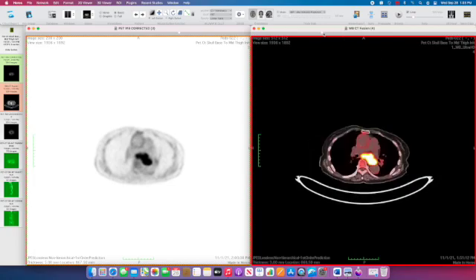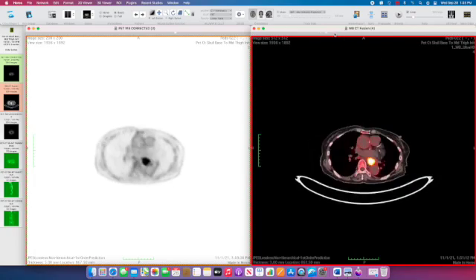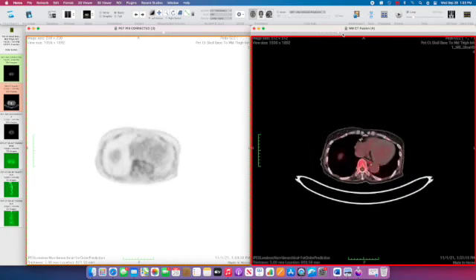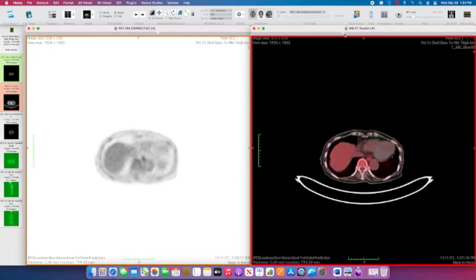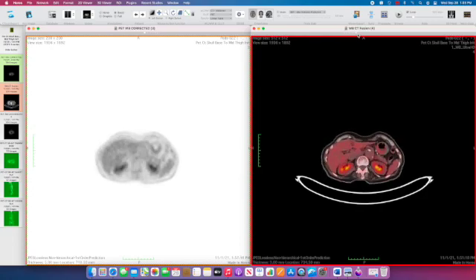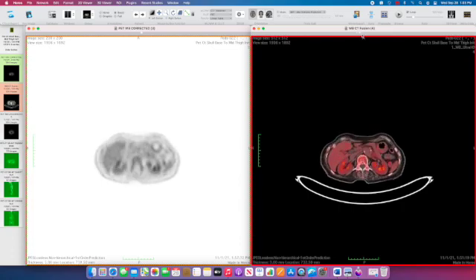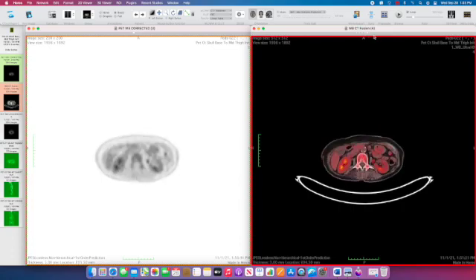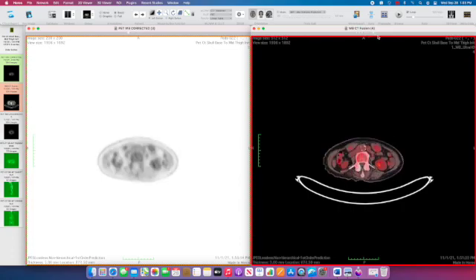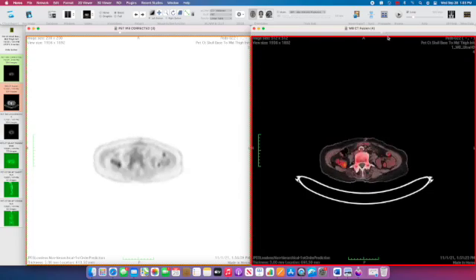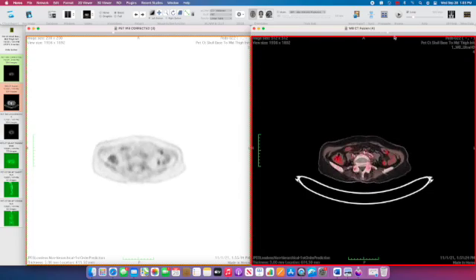To quickly go through the other findings in the abdomen, we would be on the lookout for any liver metastases, which I don't see in this patient. It's normal to have FDG excretion in the renal collecting systems and bladder. And some degree of mild linear activity in the bowel is also normal.